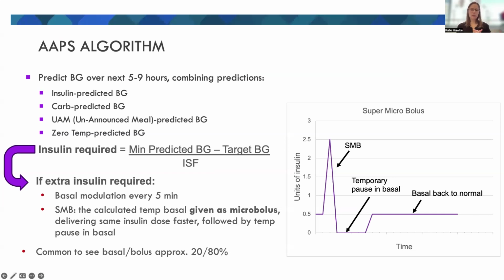And broadly on aAPS, we have the opportunity to do very similar kinds of temporary percentage profiles as we talked about with Loop's custom presets. So the user can simply change their profile to 120% or 50% as may be relevant for exercise, etc. And you can set temporary targets as well.